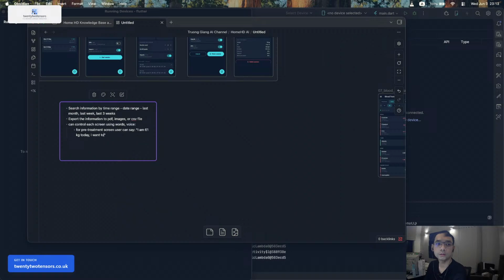I want to take out 2 liters in 4 hours. My blood pressure is 120 over 70 and 89.